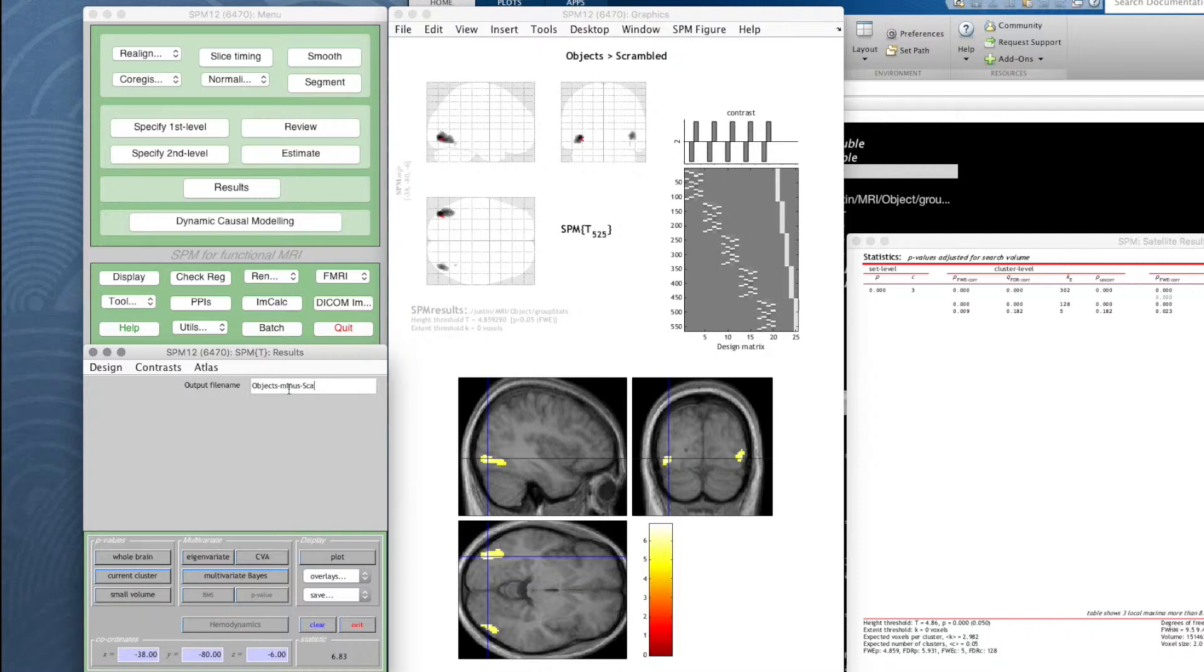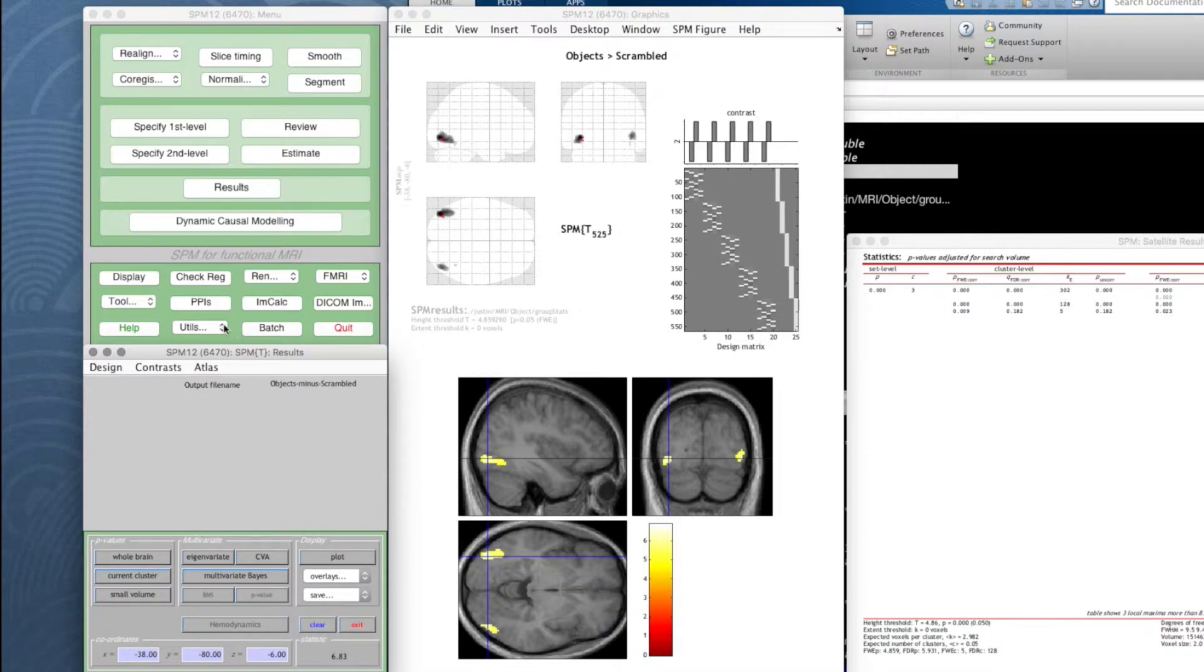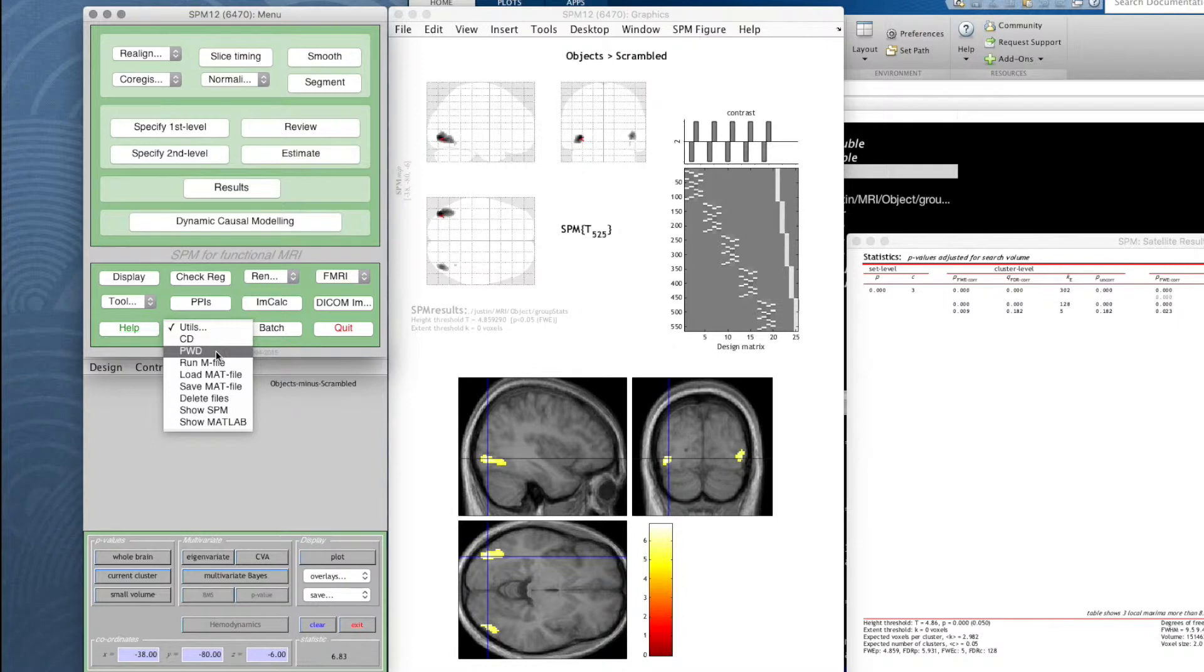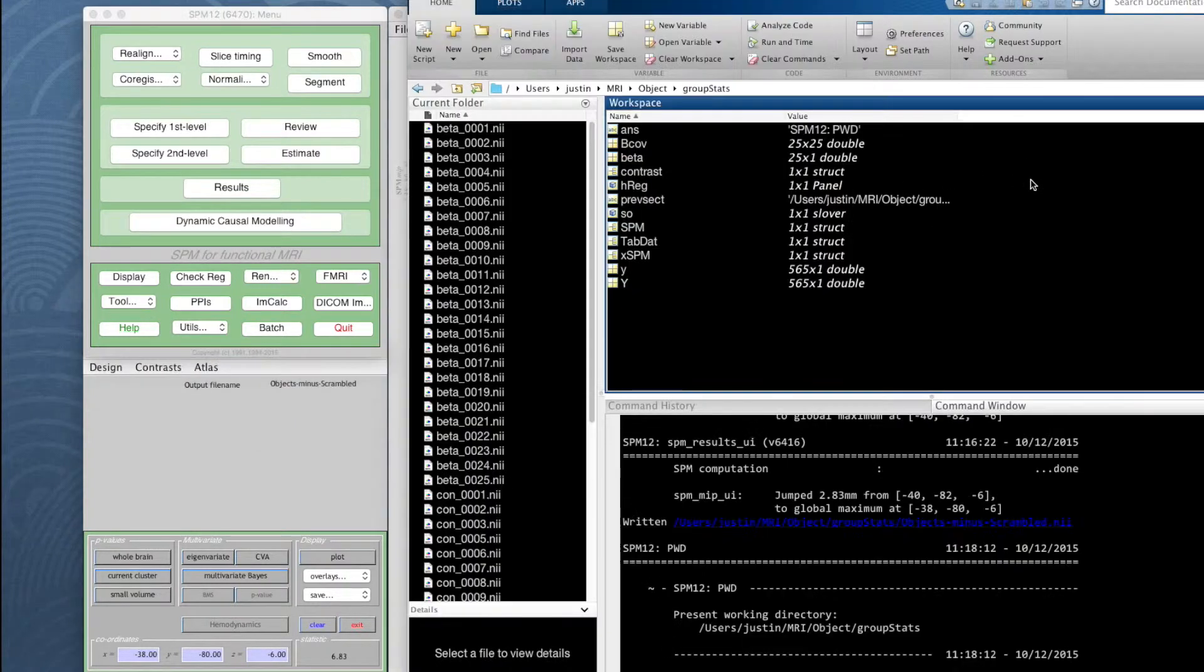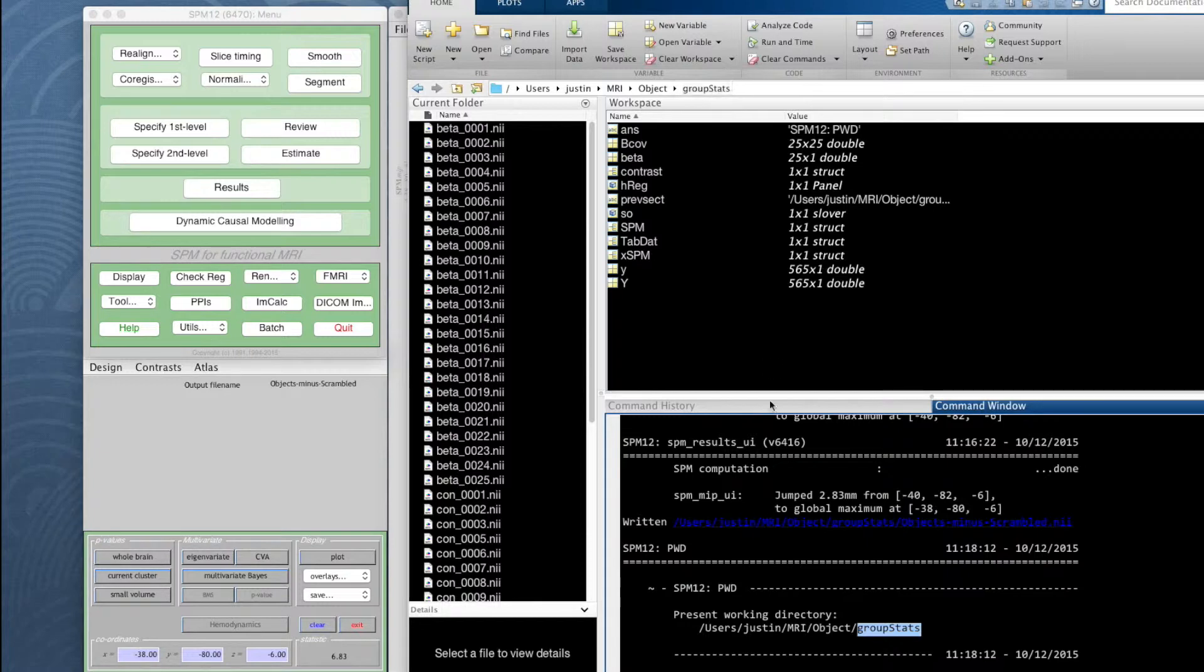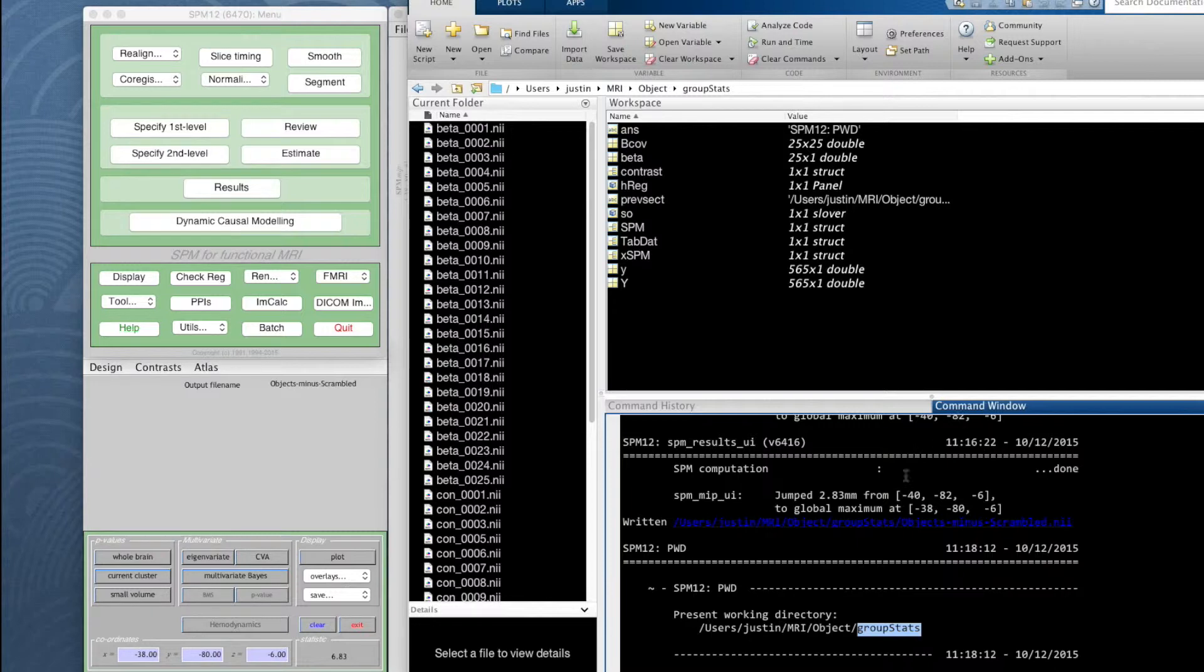I wonder where it's put that. If I go to utilities, PWD stands for print working directory. It tells us what directory we're in. It says we're in our group stats directory. MATLAB nowadays tells you all these things anyway. As ever the command window has all the useful information. It has written objects minus scrambled dot nii file in there. Fantastic.